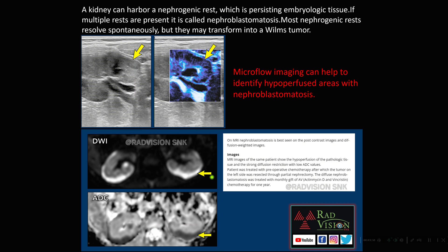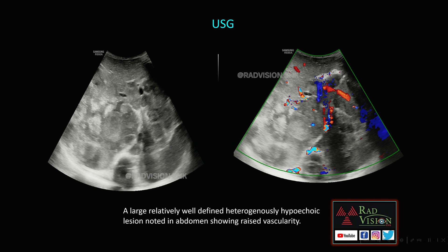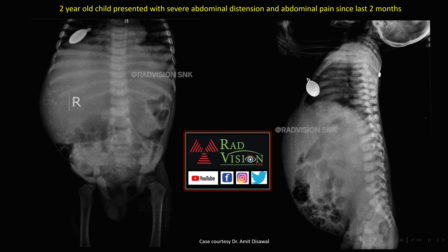This case on MRI shows typical restricted diffusion on DWI noted in a subcapsular location, with hyperperfused areas on microvascular flow imaging. This is a classical case of bilateral nephroblastomatosis. On MRI, nephroblastomatosis shows restricted diffusion with low ADC values and is a precursor for Wilms' tumor, so these cases should be closely followed.